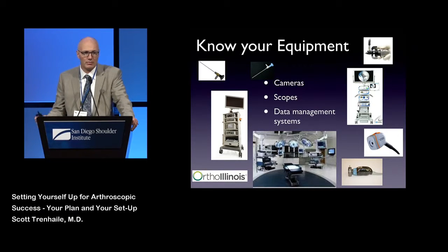You need to know your equipment, certainly the cameras, the scopes, the data management systems, and so on. And invariably, there's always something that goes wrong when the person who knows how to fix this leaves the room and you're left guiding someone who has no idea. So I think the more you know, the better.